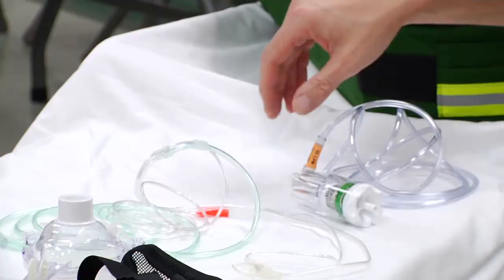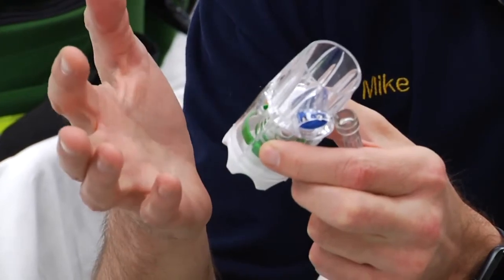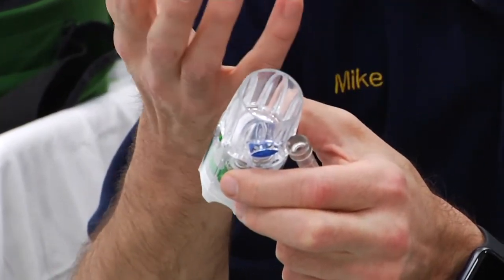When we set up this device, we're going to look at what the manufacturer recommends for flow rate. On this particular device, it says on it 10 liters per minute is what's going to flow through this. So we'll attach it to the oxygen. We'll connect it to the actual CPAP device. And you have a choice of pressures that you're starting at. So we're administering CPAP in centimeters of water pressure. Typically, we would start CPAP somewhere between 8 and 10 centimeters of water pressure. You need to look at your local protocols and say, where do you recommend that we start the CPAP?